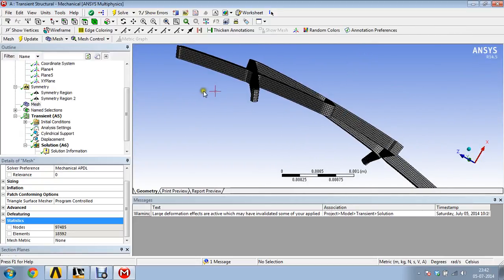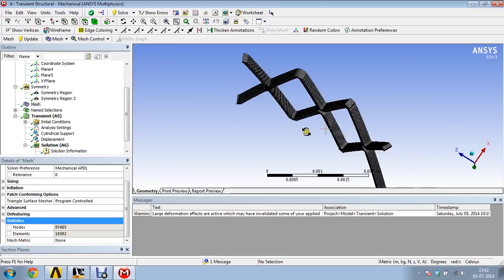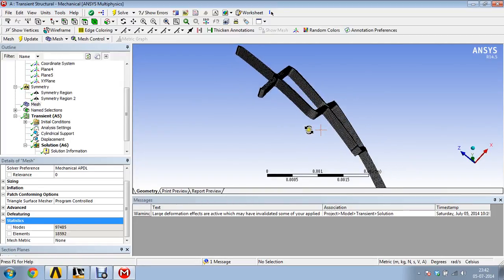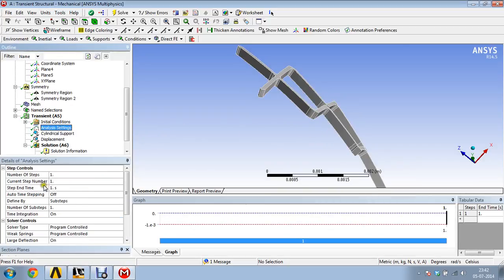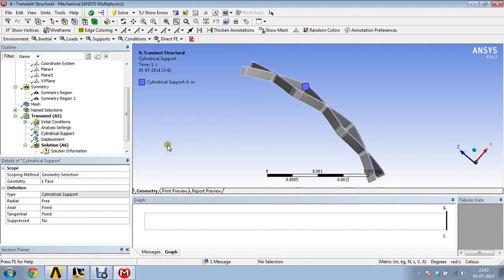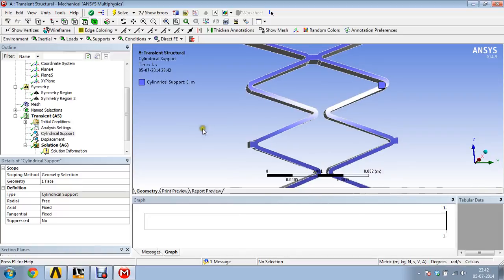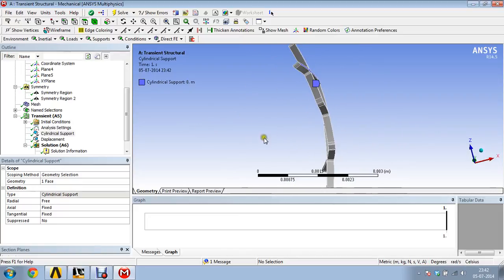We have seen that this is an axisymmetric model, which means that when the stent applies some kind of pressure on the inner wall or outer wall, it should expand in proportion to it. Analysis settings can be done on it, and there is only one step. Cylindrical support has been given, and the major thing to define is that in the cylindrical support, radial is free and axial and tangential are fixed. So there is no movement in the axial as well as tangential direction. There is movement only in the radial direction, so it will move only in this direction.